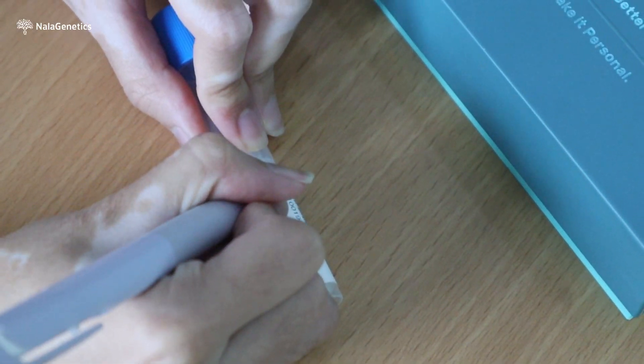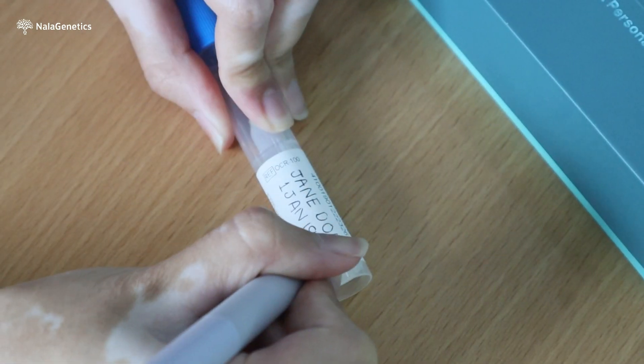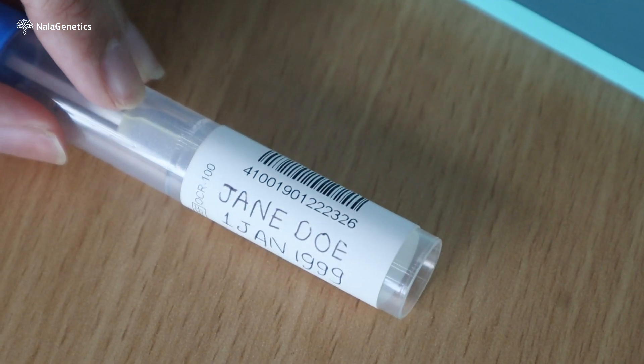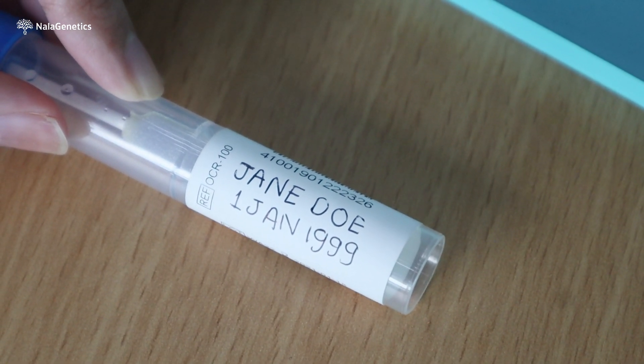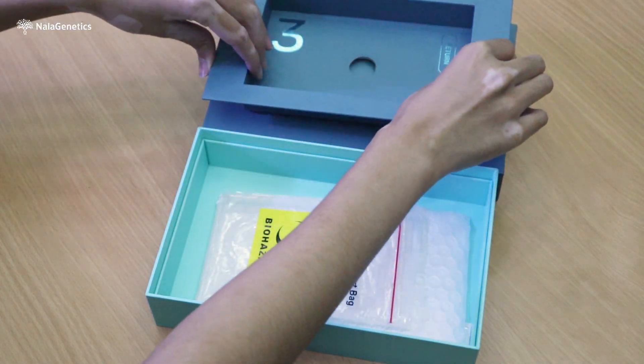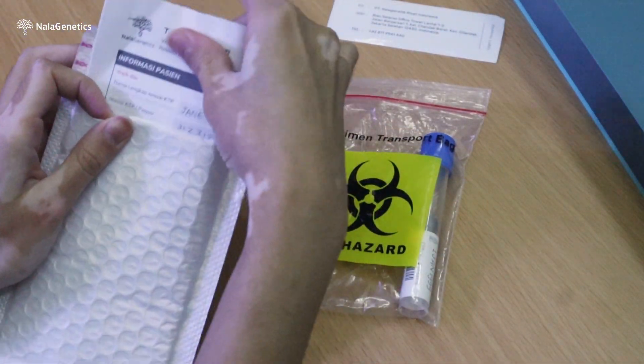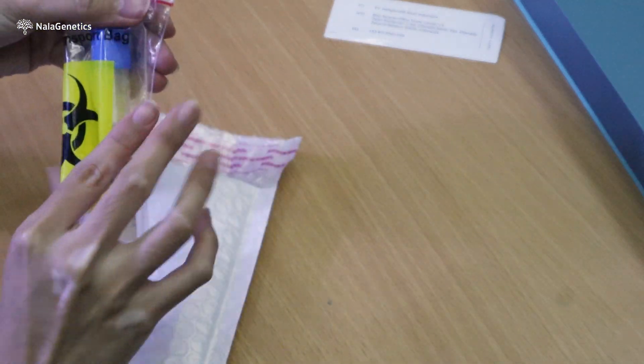Write down your name and date of birth clearly under the barcode number using permanent or indelible ink. Make sure you don't overwrite the barcode number. Take out the biohazard pouch and insert the tube into the pouch. Then insert the biohazard pouch, test request form, and consent form into the polymailer.